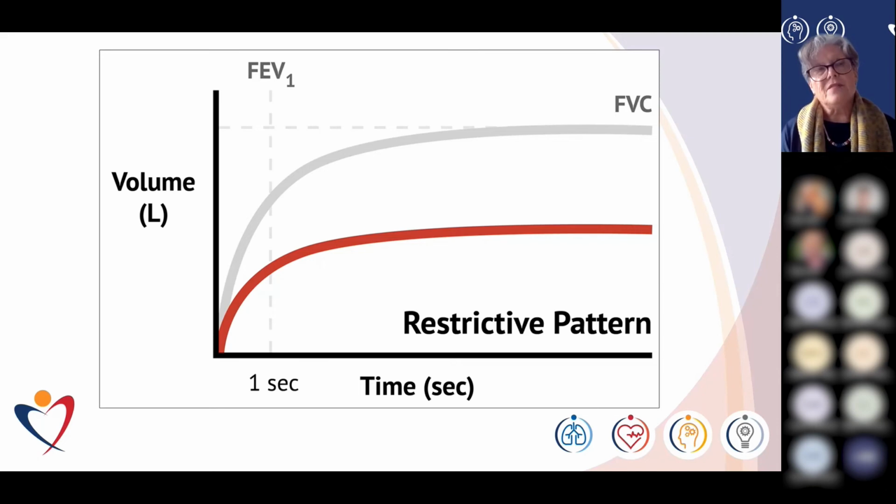There is another pattern that you might be familiar with, and it's called combined pattern. Sometimes it's referred to as obstructive with superimposed restriction. It means the same thing, but it's a combination of both. So the airways don't quite achieve FVC. They don't quite get to the volume that they used to before the airways became even more diseased.